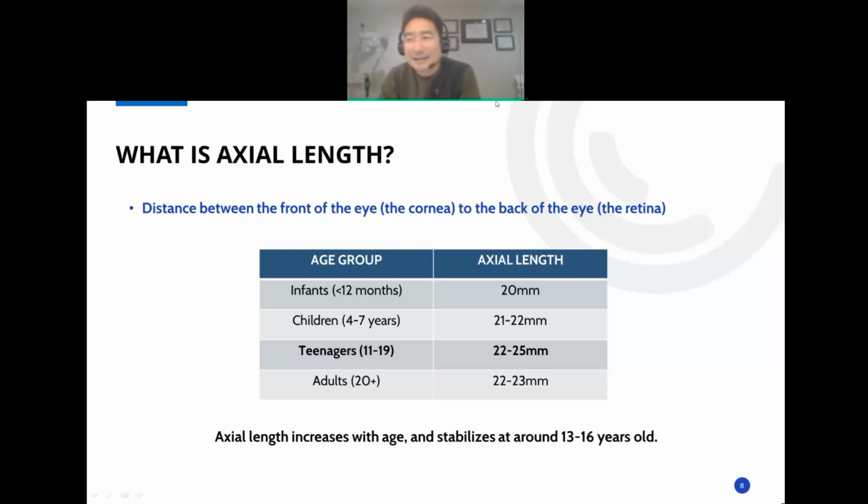But with all these tools now, I don't think it's a good idea to even fit them with normal glasses. We have the Hoya MiyoSmart. So I will go with that lens instead.